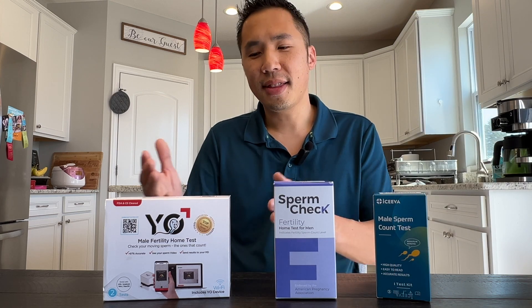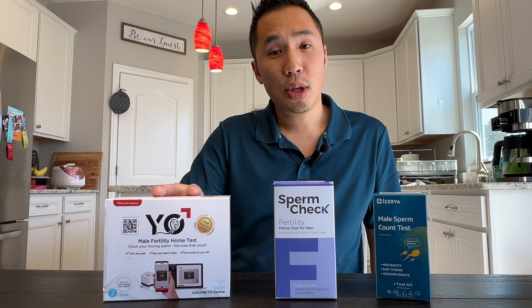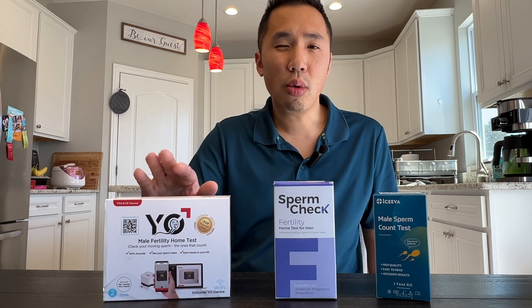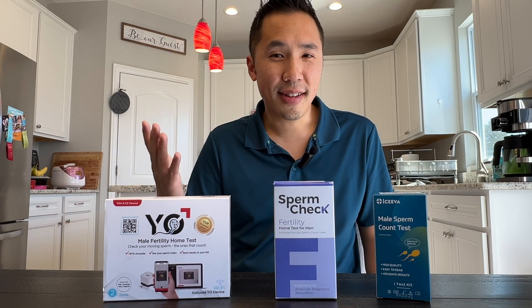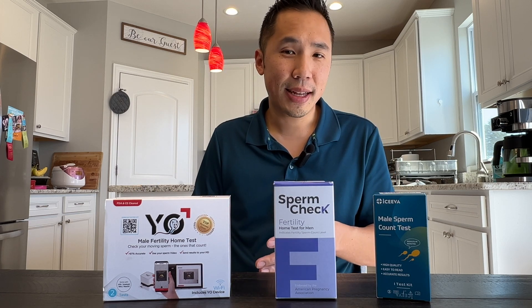I also like that the Yo male fertility test comes in multiple packs. It comes with two as the starter kit, but you can also do the four pack or the six pack along with the device. If you decide to go with the two and find that you need more kits later on, you can just buy the replacement kits — you don't need to buy the whole device again.